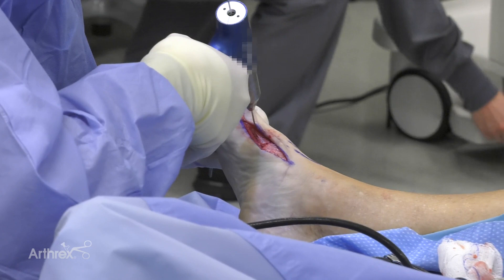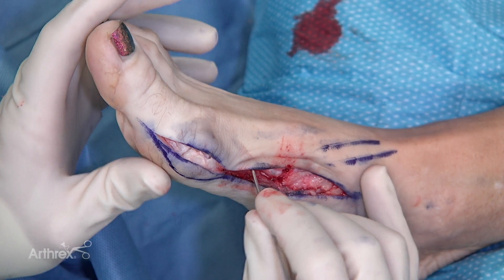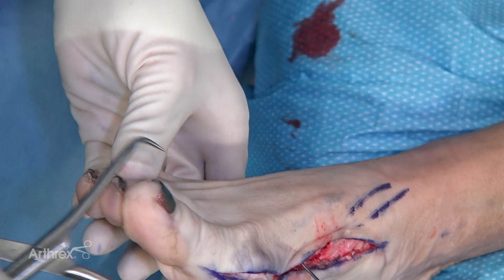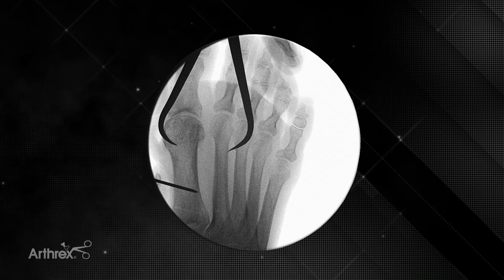I like to place the K-wire in the metatarsal itself — that helps me with my reduction. On her preoperative axial view she did have some valgus rotation of the metatarsal, so we're going to use this as a joystick to help reduce this back. You can see by simply taking this, she's in a valgus position here, and when we rotate the metatarsal out it starts to make the medial eminence disappear and starts to bring everything back into alignment. I also use a large clamp placed on the second metatarsal, and I like to place it on top of the first metatarsal more towards the dorsal side, which also helps me rotate this into a reduced position.